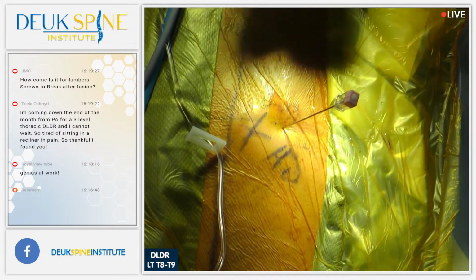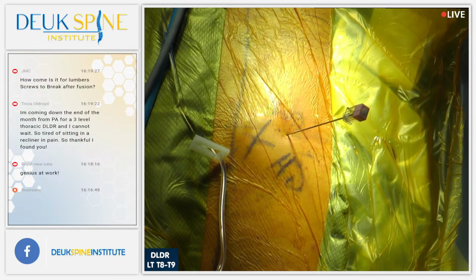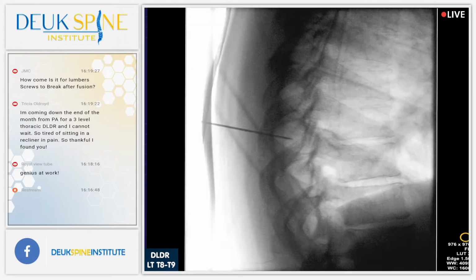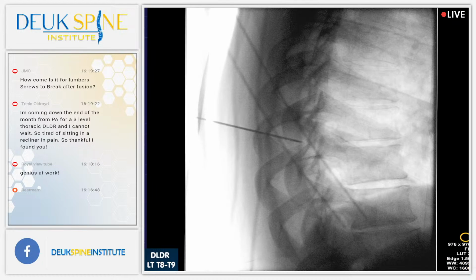All right, so he's moved a little bit on orbit. I think you'd have to bring my side up. There you go. Try that. Try more. Maybe we're too far. Don't move. No, I don't think we're too far. Keep going. That looks pretty good to me. Shot.